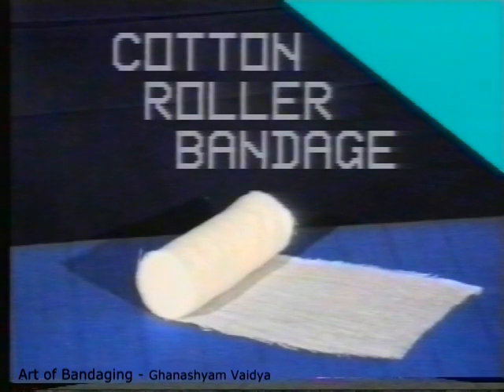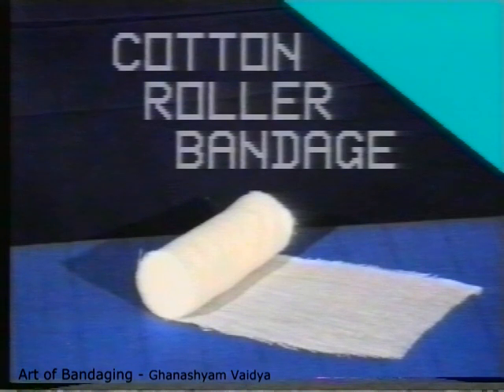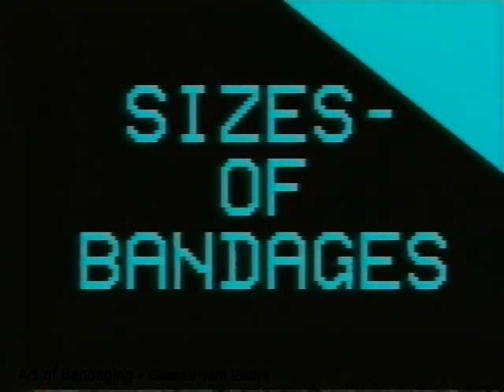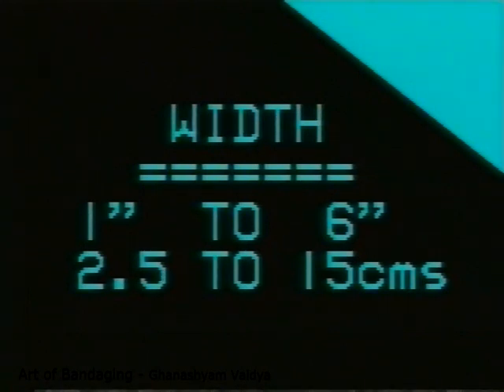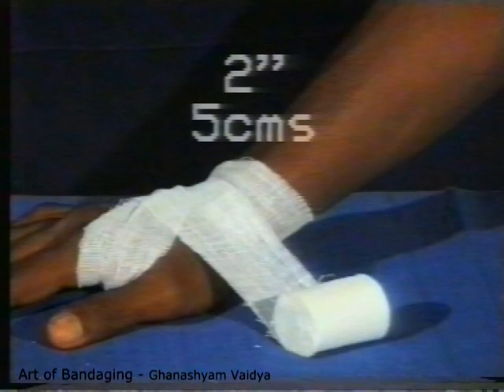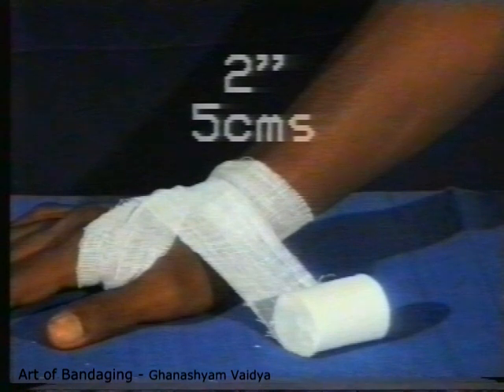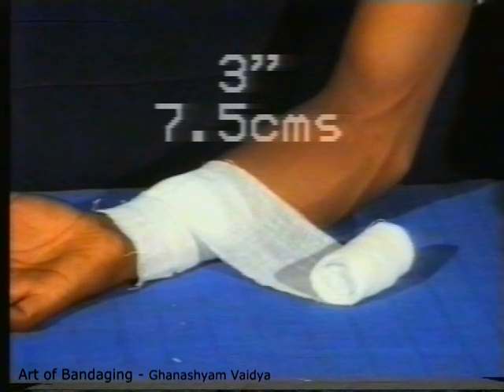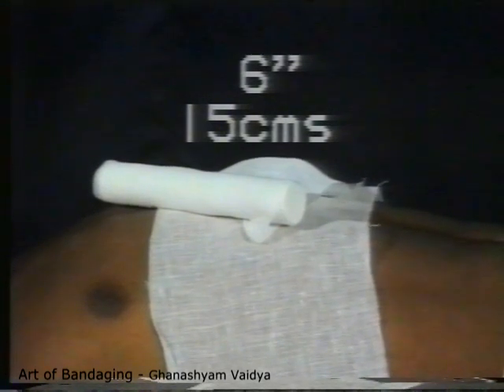Having seen the various types of bandages, let us now concentrate on cotton roller bandages. The bandages are available in different widths, ranging from 1 inch to 6 inch, that is 2.5 to 15 cm. You should always choose a bandage of the correct size. For fingers, use a 1 inch bandage. For wrist, hand and arm, use a 2 inch bandage. For forearm and leg, use a 3 inch bandage. For thigh, buttocks, hip spica, use a 4 inch bandage. And over the chest, breast and abdomen, use a 6 inch bandage.